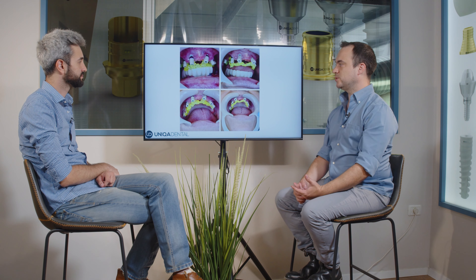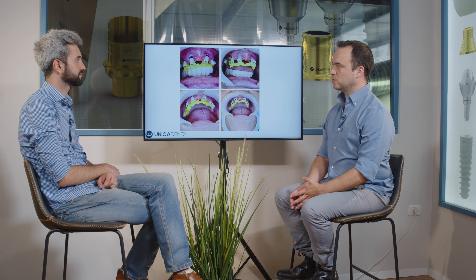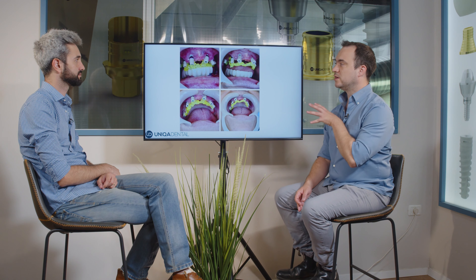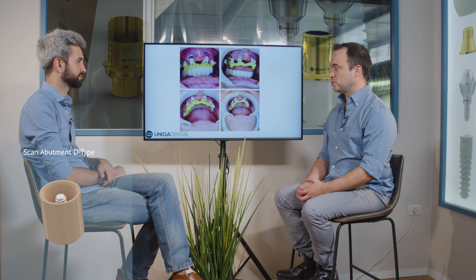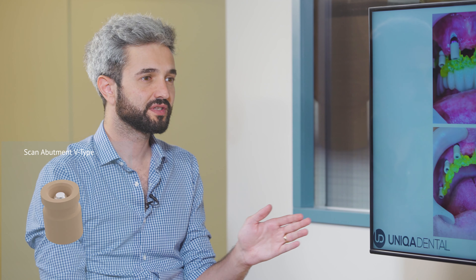Right now we want to first take impressions. We weren't sure what kind of multi-units we would want to use in the anterior area. Around the anterior implants we had some gingival recession, so the implants are visible. We needed to use angulated multi-units. So we chose to take impressions on the most suitable angulated multi-unit we thought would be fine for this case. And because we don't want to call the patient again, we took implant-level impressions as well. If those multi-units won't be suitable, we'll have all the options. When you're using an implant-level scan abutment, you can switch for every multi-unit from the library.